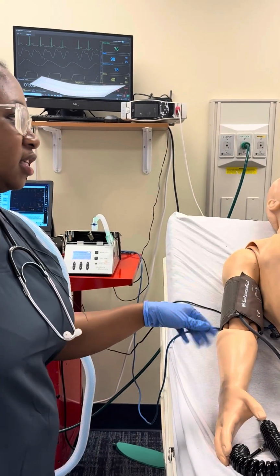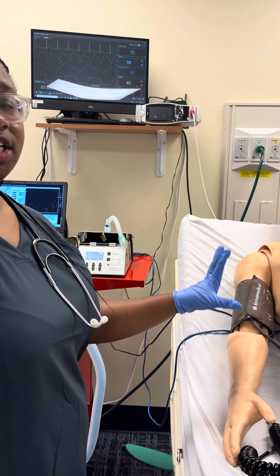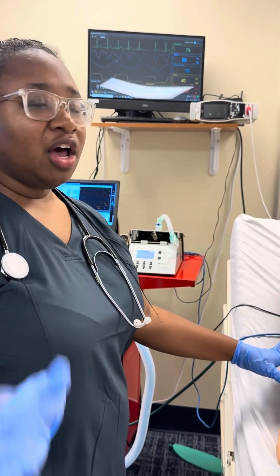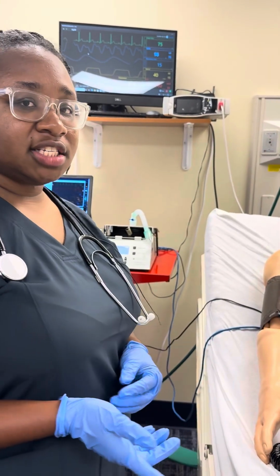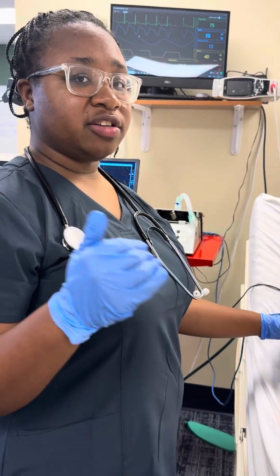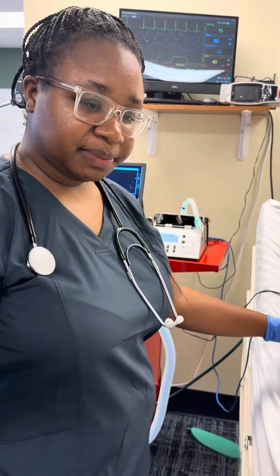So the purpose of putting a patient on mechanical ventilation is to improve oxygenation and correct acid-base balance. A risk would be oxygen toxicity, but we'll titrate Miss Haley's FiO2 to maintain her saturation within normal ranges.